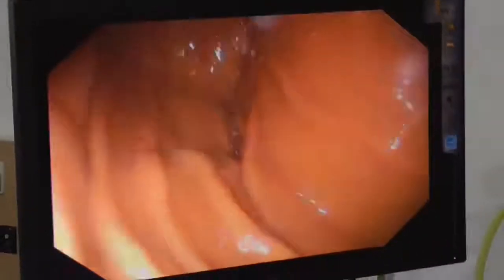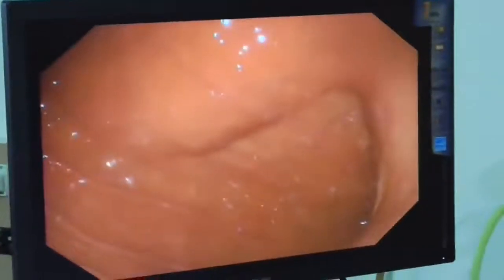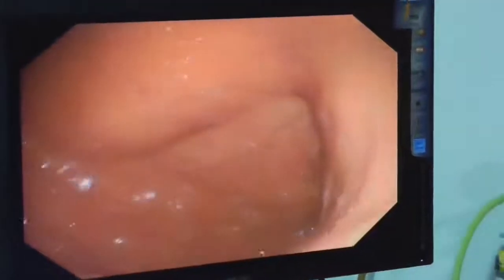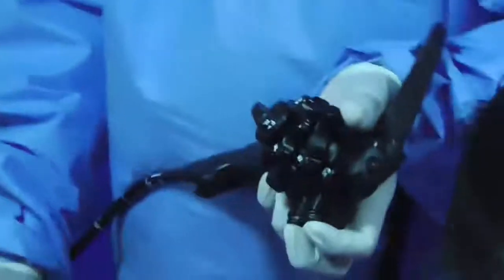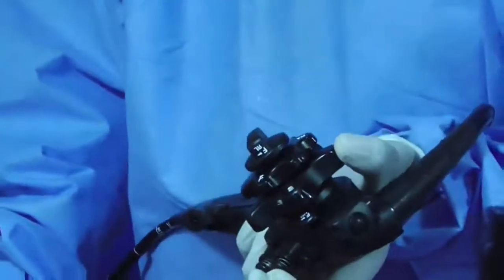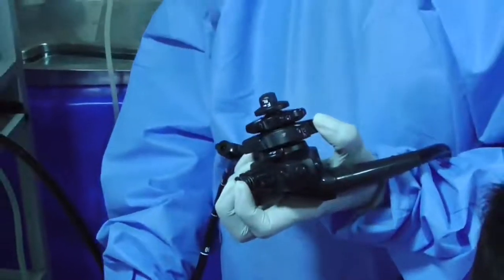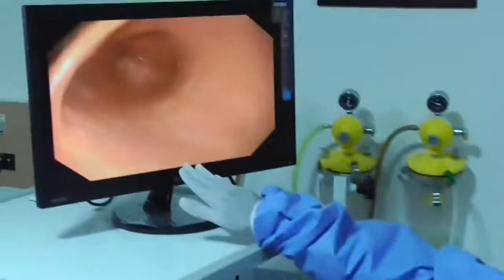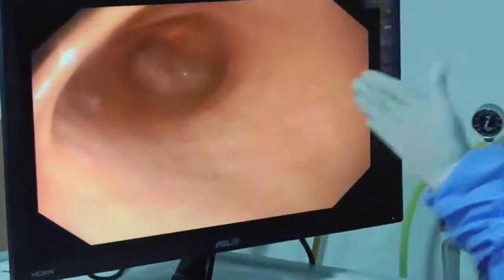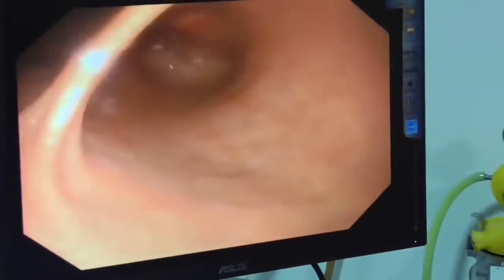Entering the stomach is confirmed by recognizing multiple longitudinal rugal folds. Check there is no fluid collection in the fundus — if there is, suck it out. You need to navigate towards 3 o'clock on the monitor; 9 o'clock leads toward the fundus. To navigate to 3 o'clock, watch my left hand: I perform three movements — turning the big wheel towards me, pushing the scope, and torquing clockwise. Push further if needed. You will walk along the greater curve at 6 o'clock, with anterior wall, posterior wall, and the lesser curve at 12 o'clock.